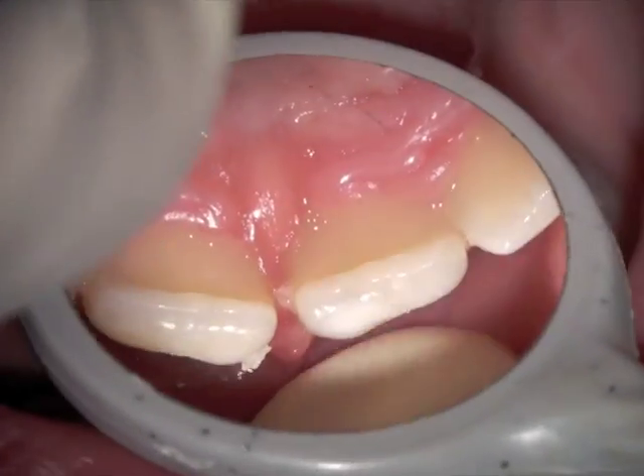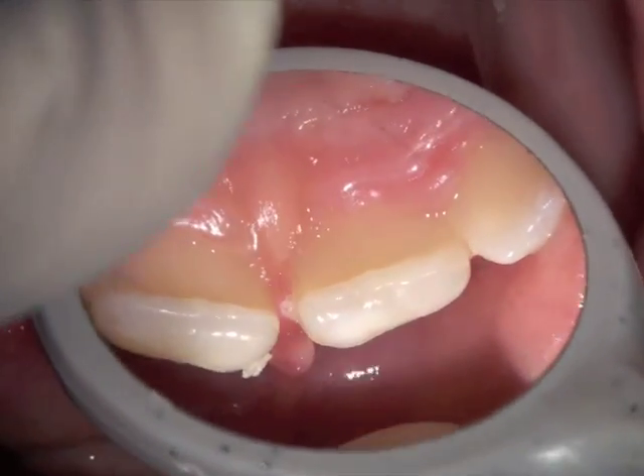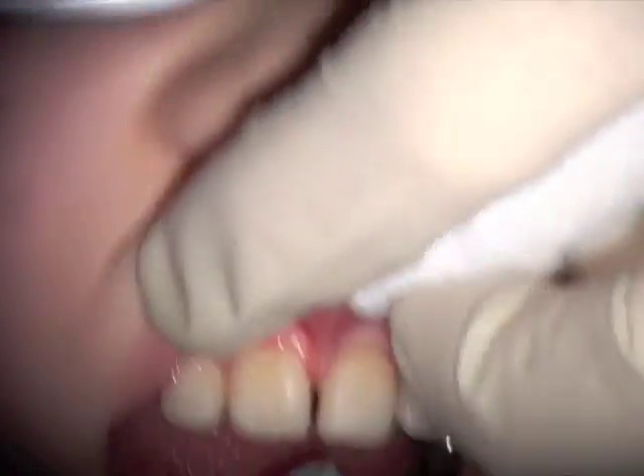This can be done at any time, both with the orthodontics or prior to the orthodontics. We see the diode laser now being used.